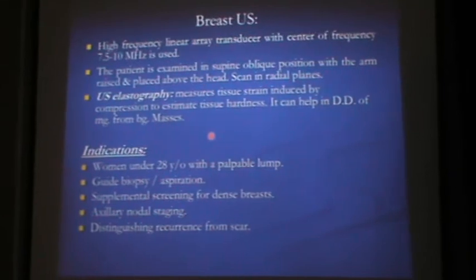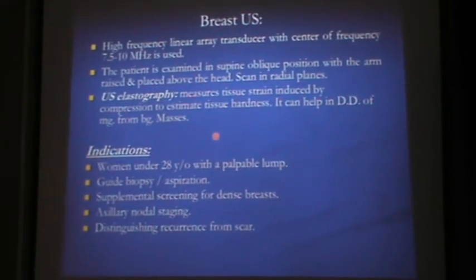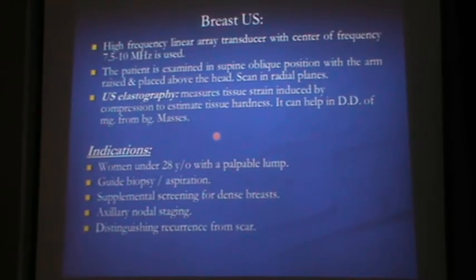The indications of breast ultrasound are for women under 28 years with a palpable lump, guided biopsy and aspiration, supplemental screening for dense breasts, axillary nodal staging, distinguishing recurrence from scar.